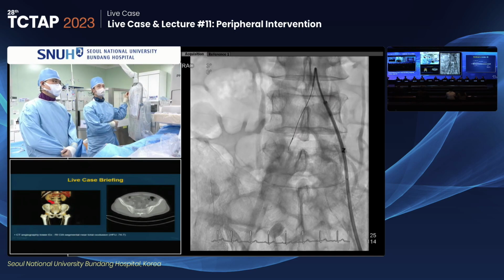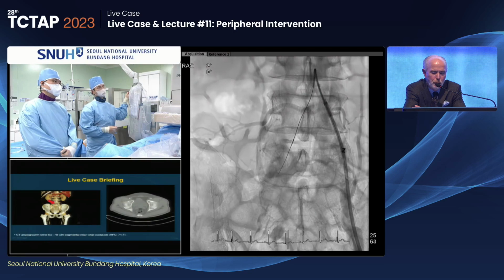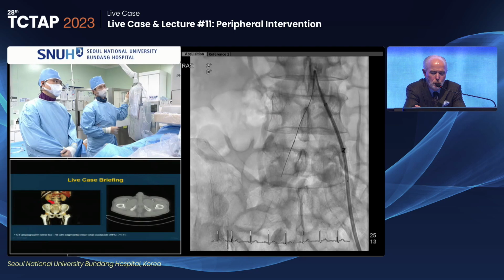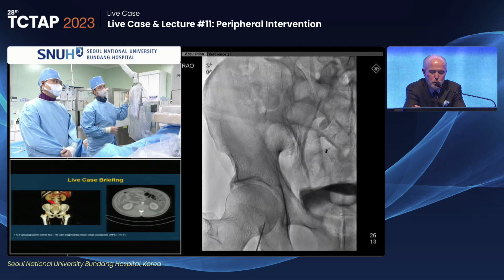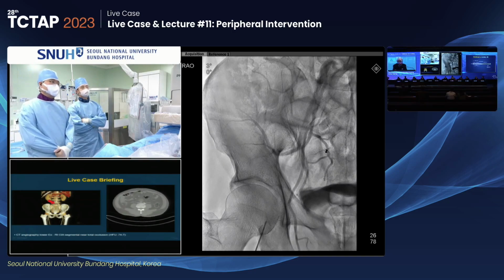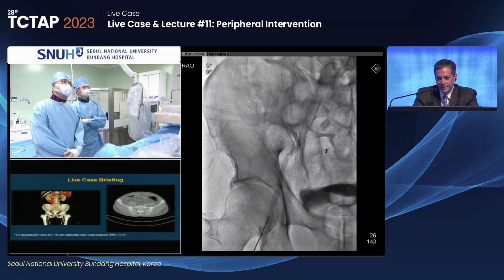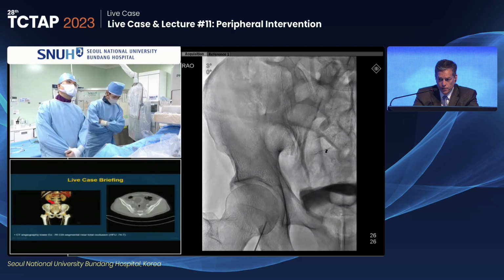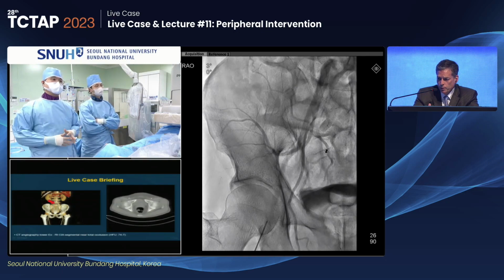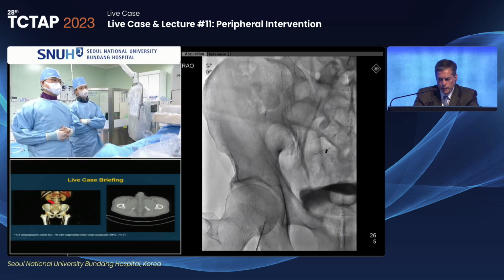Yeah, anyway, just a question: when you stent the right side, whether you're going to shift plaque to the left side, particularly given the moderate disease that's present there. I would be prepared to treat the left as well. But it certainly demonstrates this idea that short lesions still are very difficult sometimes, even with good technique, that you can still get into the subintimal plane, which is sometimes unfortunate. But that other projection really does show you how it looks in the AP view, like you're right on it, but you were off by quite a bit.